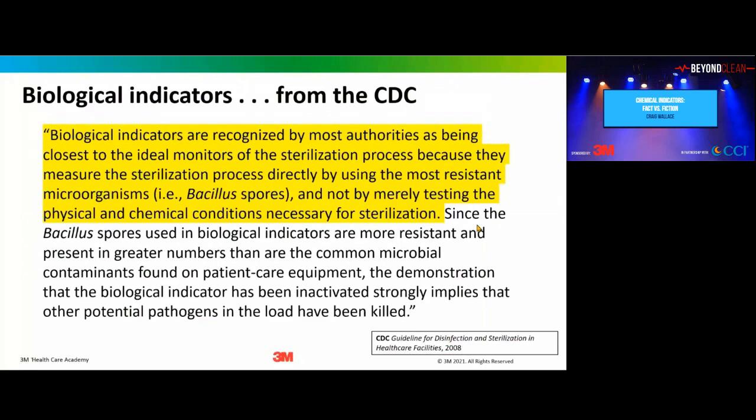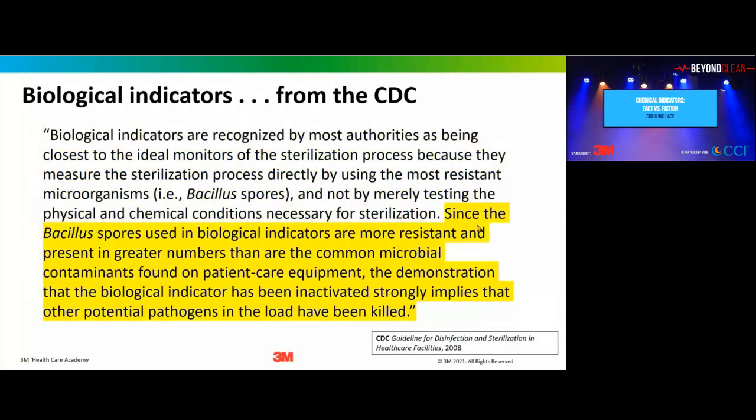And then the second part of it is, since the spores used in these biological indicators are more resistant and present in greater numbers than are the common microbial contaminants found on patient care equipment. So basically they're saying that the devices you have cleaned and decontaminated and packaged and put into the sterilizer are pretty clean. They're not sterile, but they're pretty clean. But the idea is that the BI, with its very high number of really resistant organisms placed inside there, is going to have a far greater challenge than what's on your patient care equipment.